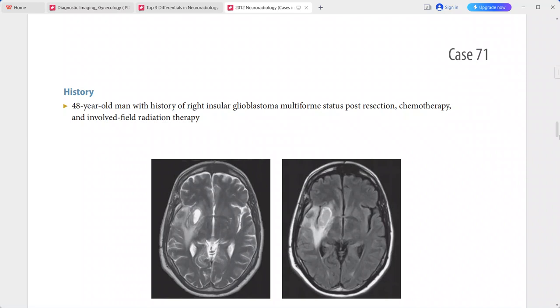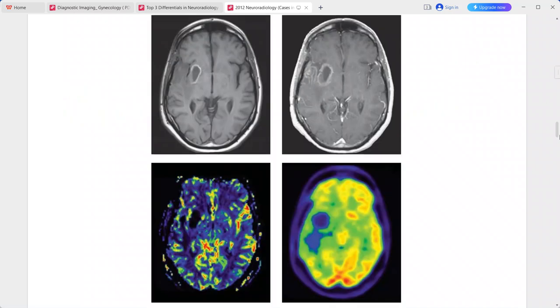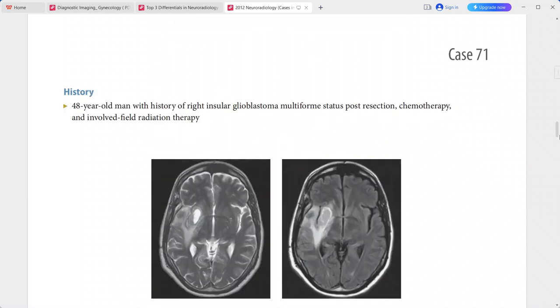A 48-year-old man presenting with history of right insular glioblastoma multiforme, status post resection, chemotherapy, and involved field radiation therapy. The images show T2 hyperintensity and mild expansion in the right anterior temporal lobe and sub-insular region.